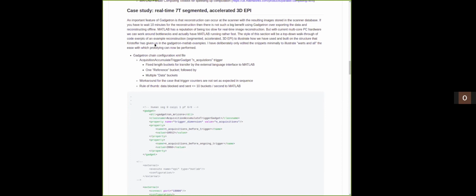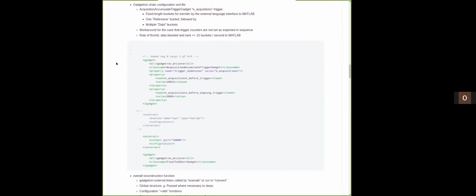So I'll walk you through some of the expanded examples starting from Christopher's templates and show what we've done to try and get Matlab to run in this application. I've literally cut and pasted. I've tried to only edit where there's stuff I really wanted to hide. So there are some occasional comments to show that this really is prototype code. To start with, we have an XML file.